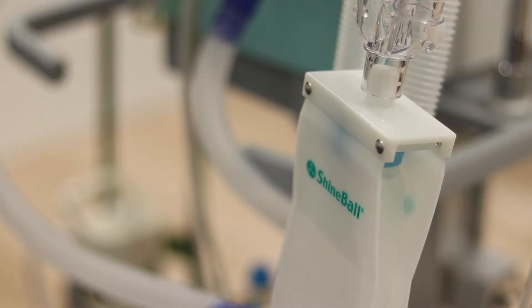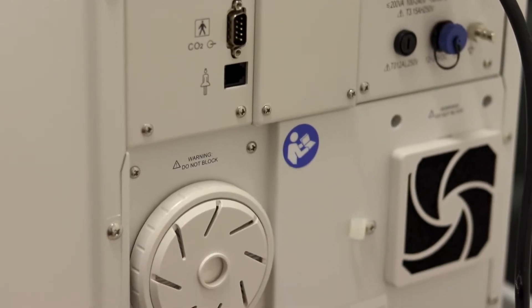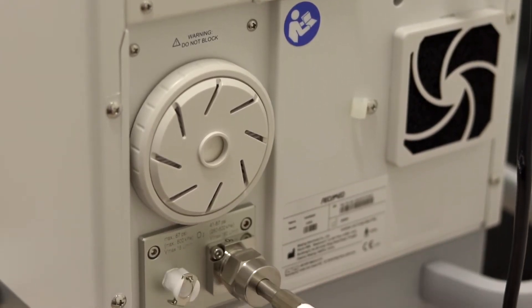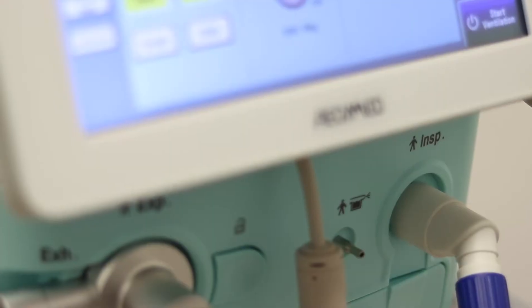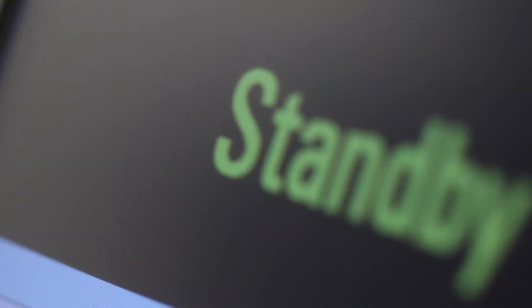The device runs easily off of a four bar oxygen wall outlet, a built-in air compressor, and a low noise turbine, so you do not need an external air compressor. The VG70s have a run of 30,000 hours. They have built-in leakage compensation at 60 litres a minute and tube and compliance compensation.